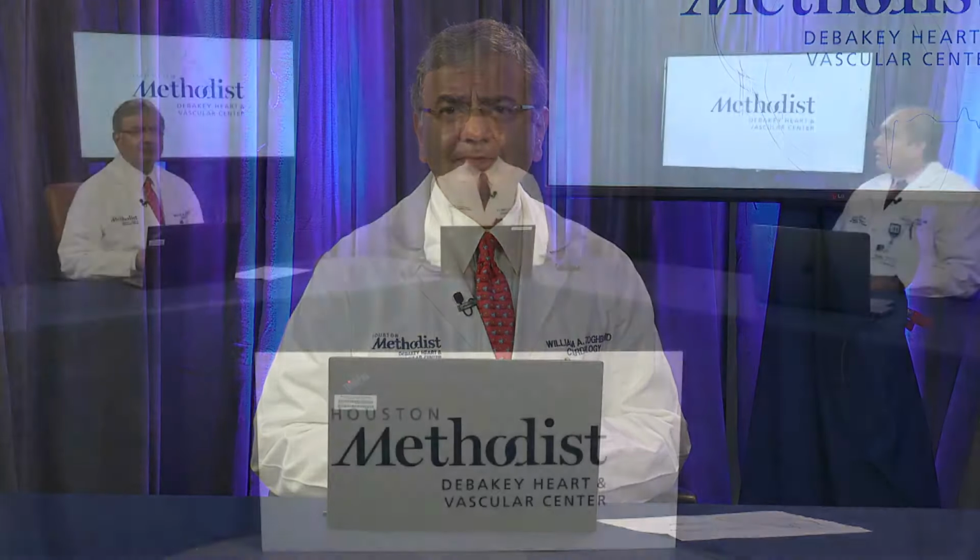Absolutely agree. And we have published a study showing that for prosthetic aortic valve obstruction, CT offers a slight advantage over TEE in determining the etiology. And also, this is not where CMR is. I mean, CMR, yes, if you're doing the study, you can get the gradient, but you're not going to look at the mechanisms of the valve itself. Is it opening well? Is there a thrombus? Regurgitation, I think probably CT would not be the first for regurgitation.